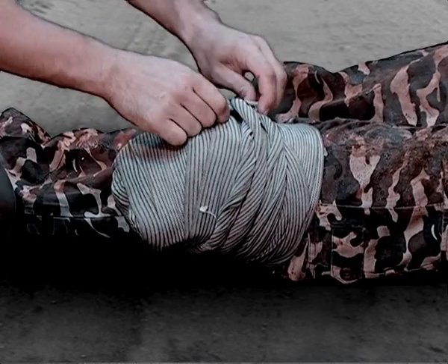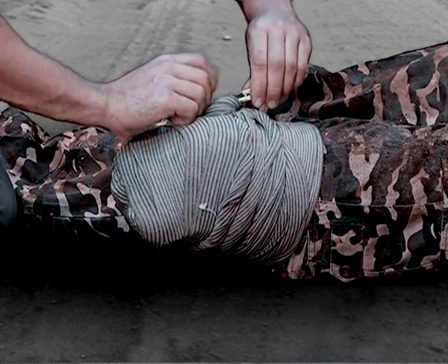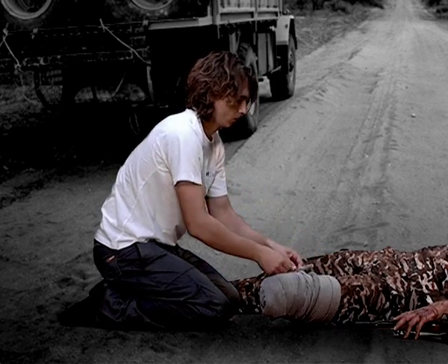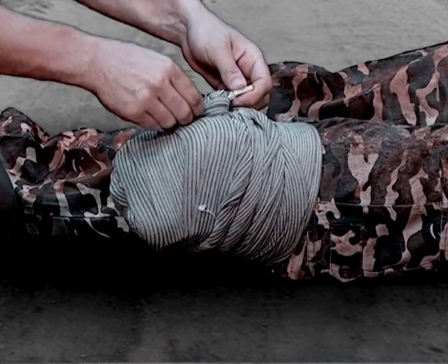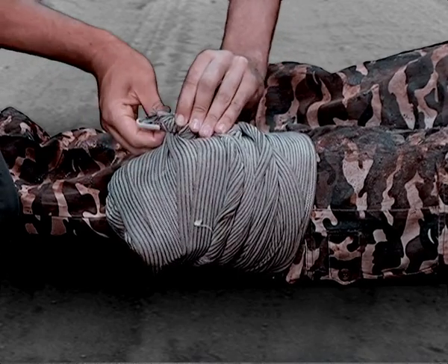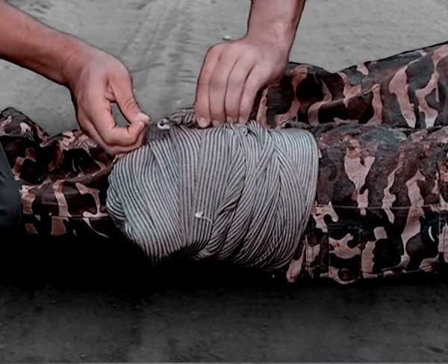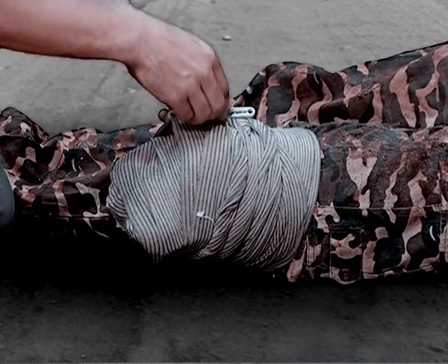Insert the closure bar in between the roped bandage with the focus positioned above the main artery and rotate. This rotation tightens the rope into a band of high pressure, creating the tourniquet. Fasten the closure bar at any convenient point on the bandage to secure the dressing.